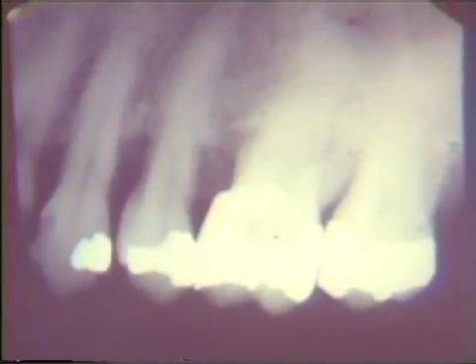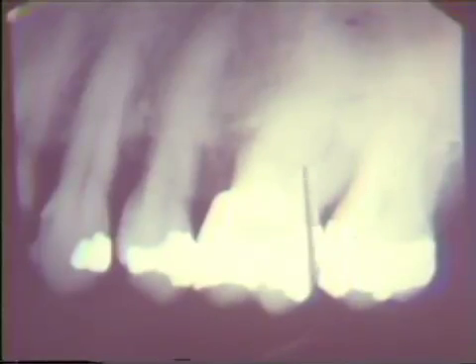Radiograms show advanced bone loss, which involves the trifurcation of the second and first molars. There is a four to five millimeter bone loss at the distal and mesial aspect of the bicuspid and at the distal aspect of the cuspid.